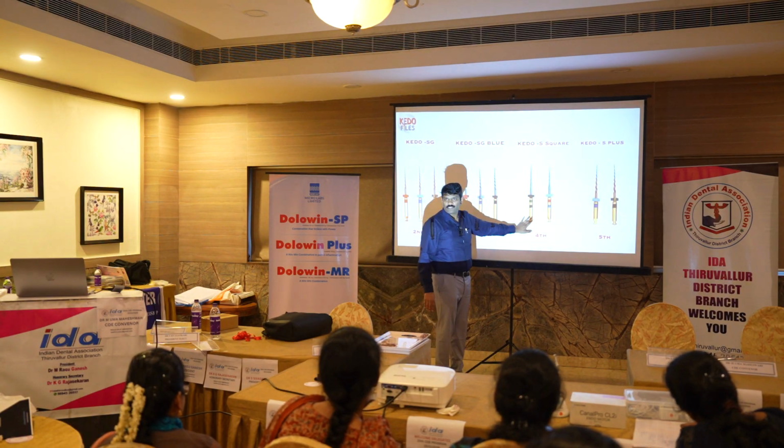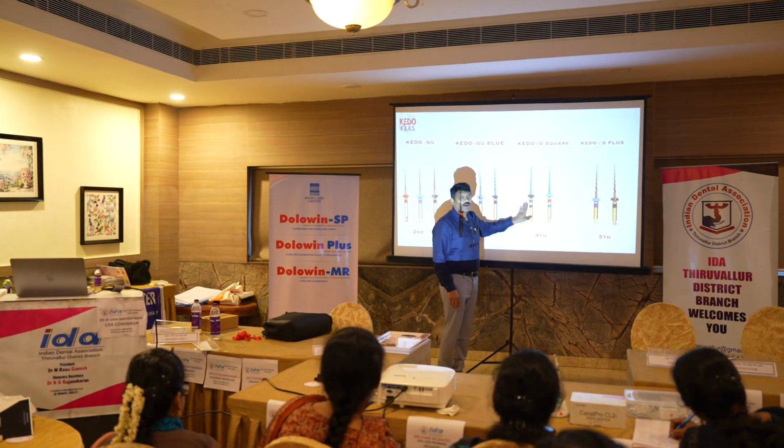Now you see single file system, one file for molar, one file for anterior. Only one file for molar, one file for anterior.